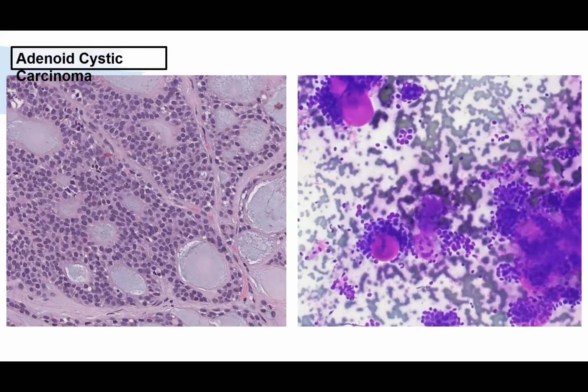This is what we would normally like to see: nice globular stromal fragments surrounded by basaloid cells, and you can see this is mimicked in the histology on the left. In view of the cellularity, as well as clinical features, such as the patient having pain, and sometimes the location, particularly the small salivary glands of the palate, this would indeed be more in keeping with adenoid cystic carcinoma.